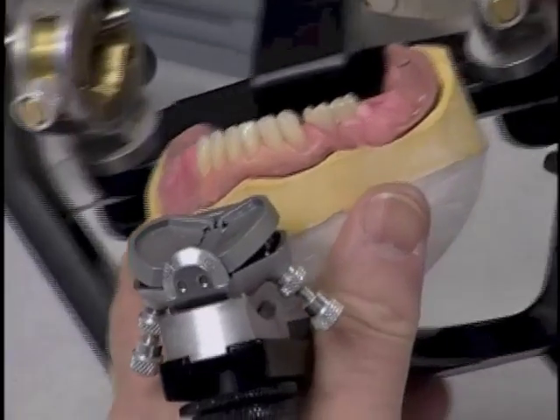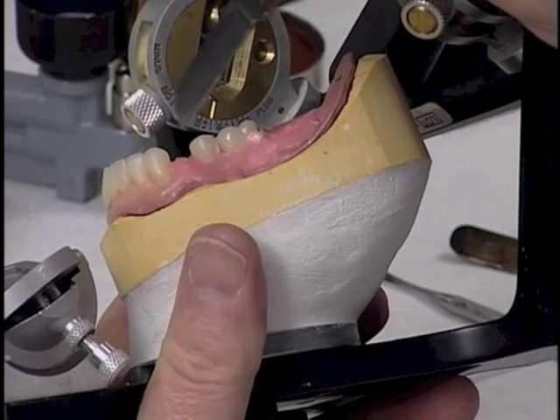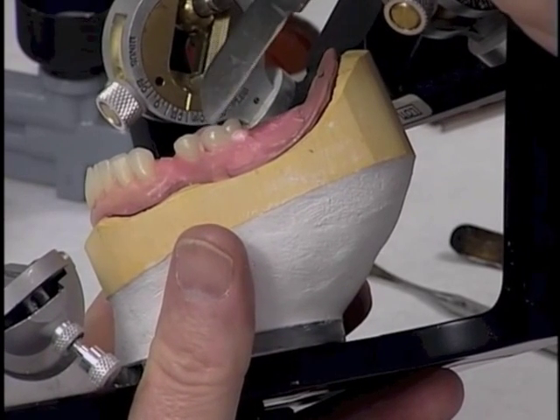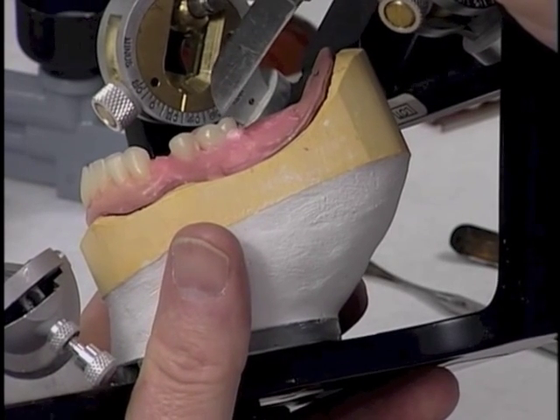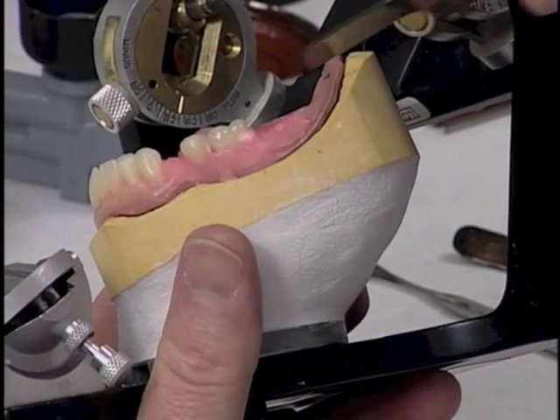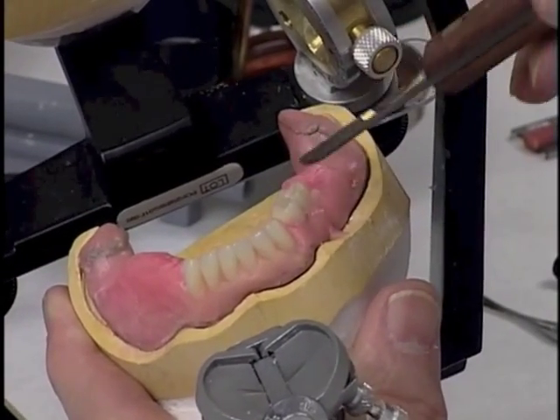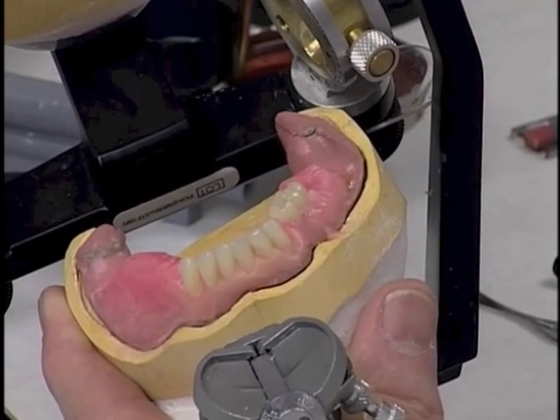It's starting that, and if we look at it from the side, we can see that when we start with the canine tip, as we come back through the molar, this begins to form a little curve, in that if we were setting these strictly flat, then this cusp would be at the same height as this cusp. But this cusp needs to be just a little bit higher so that we start creating that curvature in an anterior-posterior direction. We also need, as we do that, to make sure that the lingual cusp is slightly lower than the buccal cusp, so that we start creating a curvature in a buccolingual direction.